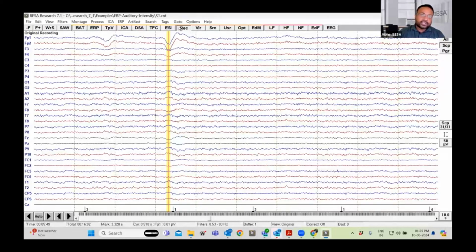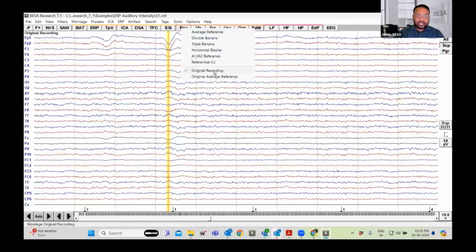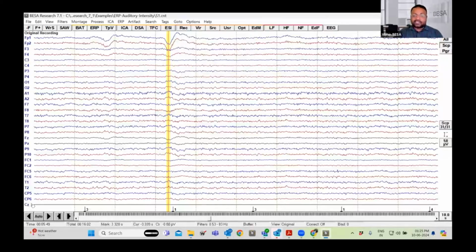So here, this is the Rec, recorded montage. So you have this original recording when it was recorded, with which you can also use this double banana, which is a classical recording montage. And all these are based on the original recordings. But we will see that CZ is flat, as mentioned earlier, because that is the reference electrode. Now let's go to another montage.